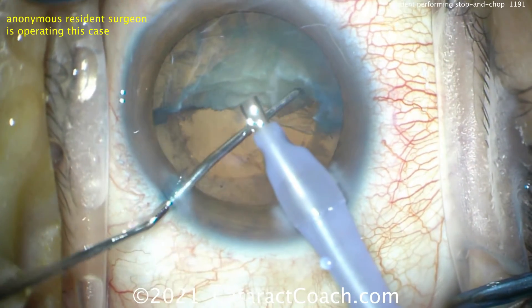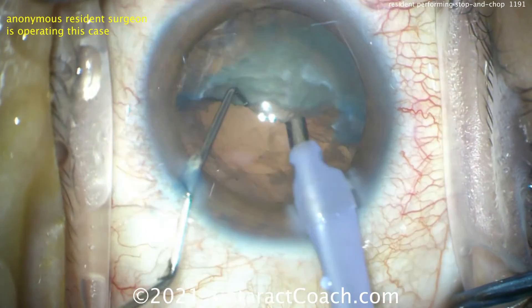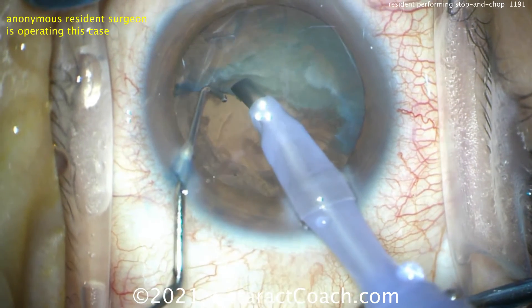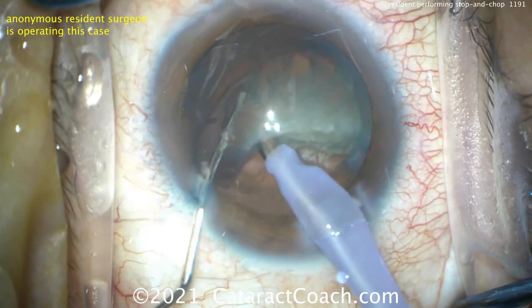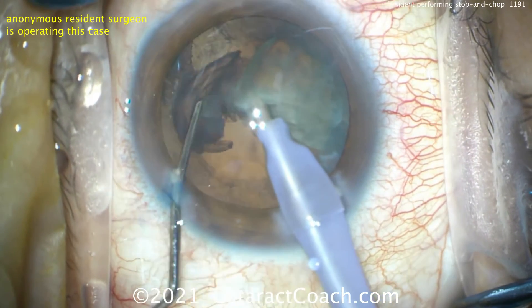Here's the second half — rotating it around and then bringing it up. Remember: don't go in the middle of the nuclear piece, but rather the end, because it's much easier to bring up one end. As that end comes up, the high vacuum is holding it, and now it can be chopped. That looks like a pretty reasonable chop.